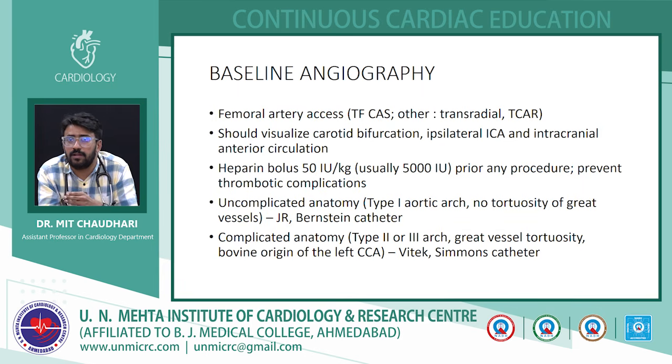The potential advantage of transcarotid revascularization is we do not traverse the aortic arch, and thus risk of atheroembolism is not seen. So peri-procedural risk of stroke or atheroembolism is less with direct transcarotid revascularization. It is done with a stent only, not like endarterectomy, but very few data is for the TCAR. Even at our institute, we mainly go with transfemoral access.